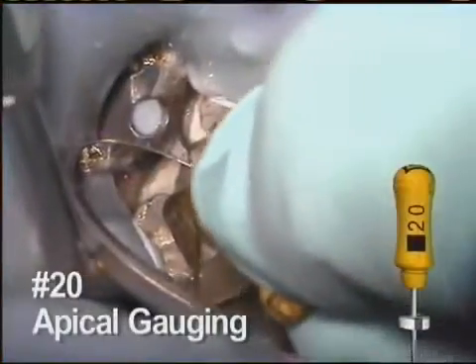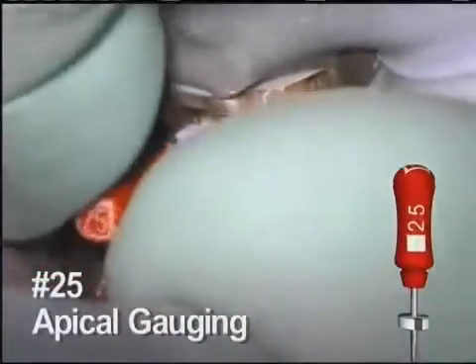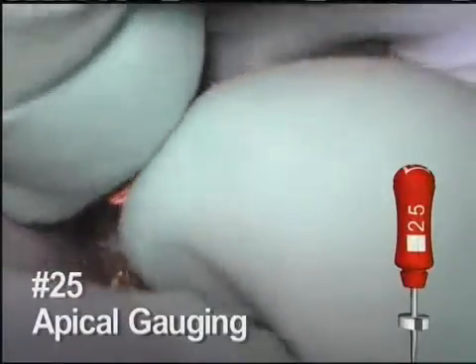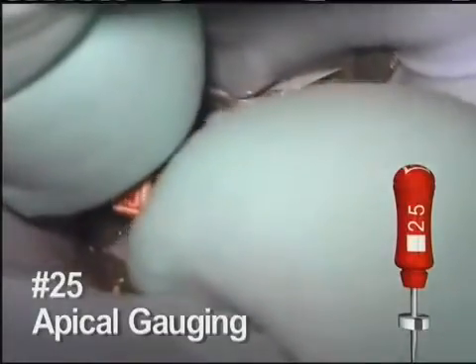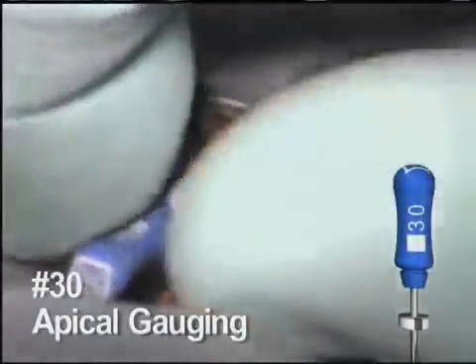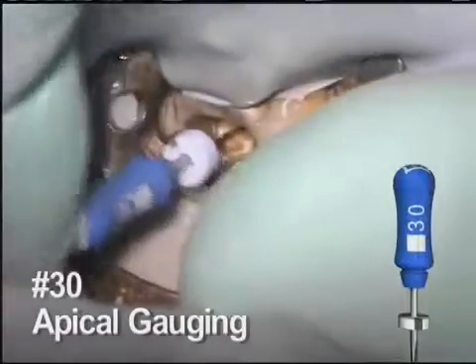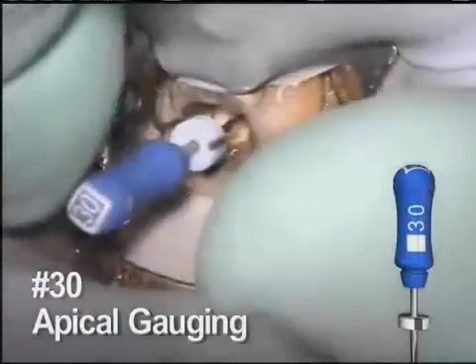Apical gauging with hand files is suggested to determine a final apical shape. In this canal, the 20 hand file fits appropriately. Although we are happy with the fit of the 20, for this example we tried the 25 hand file. It is also gently worked into the canal space. In this specific canal, it is too large and does not quite reach length. We also tried the 30 hand file, and as expected, it takes more effort to get close to the working length. Therefore, the clinical decision for this particular canal is to leave the preparation at a 20.